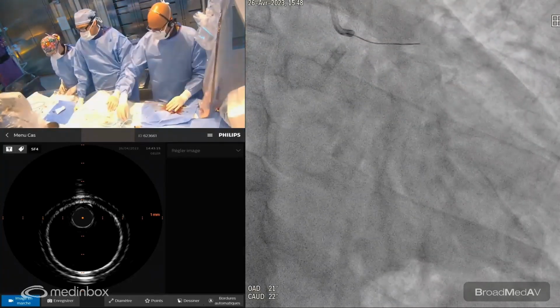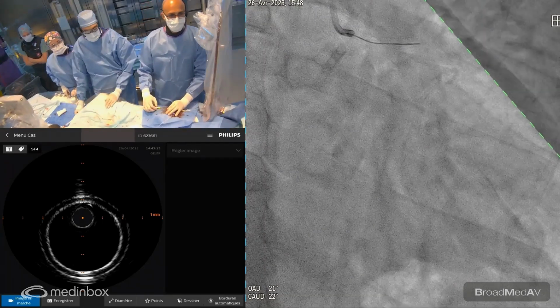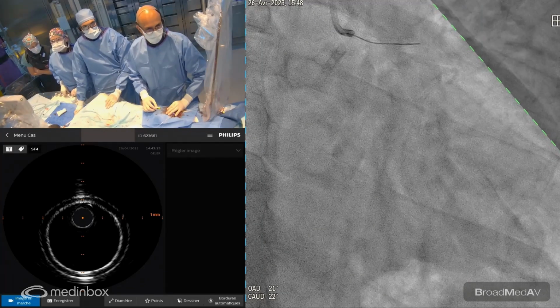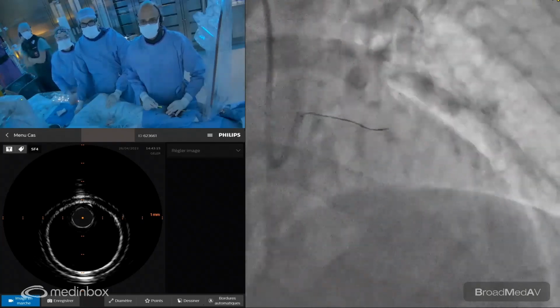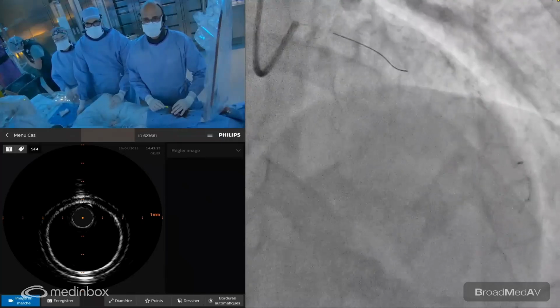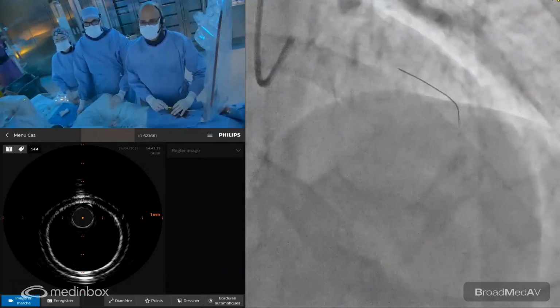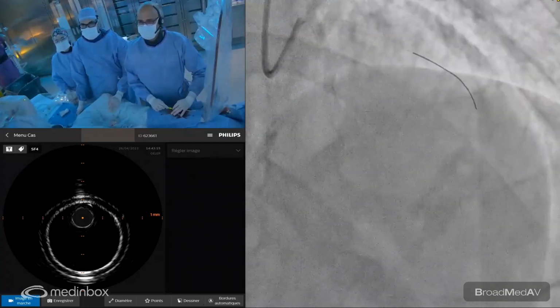Count. What's this? What's the last ACT? 302. Test.